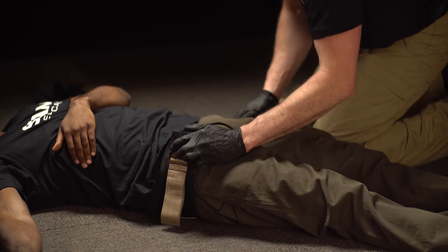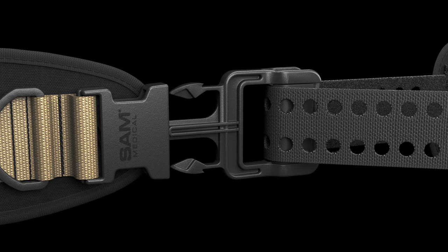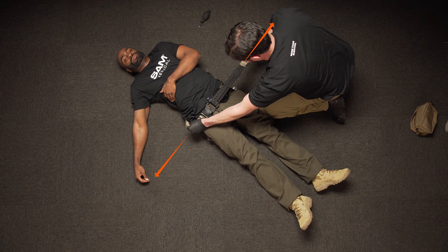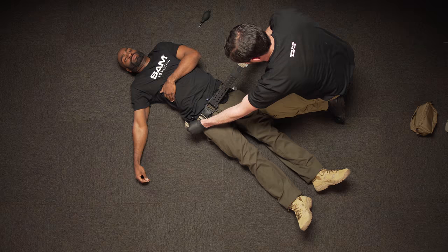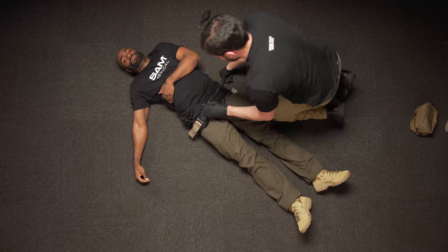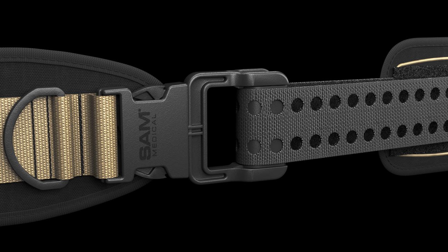Hold the TCDs in place and connect the belt using the Fast-Tex buckle. Then pull the brown handles away from each other until you hear and feel the click of the AutoStop buckle. While maintaining tension, immediately press the precision strap down onto the velcro surface of the SJT to secure it in place. Don't be concerned if you hear a second click after the precision strap is secured — the correct force will be maintained.